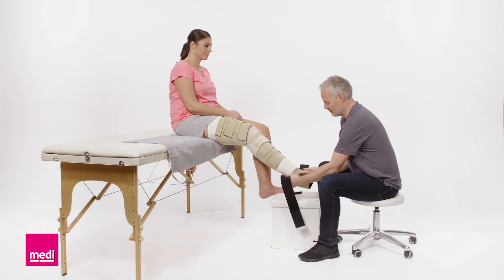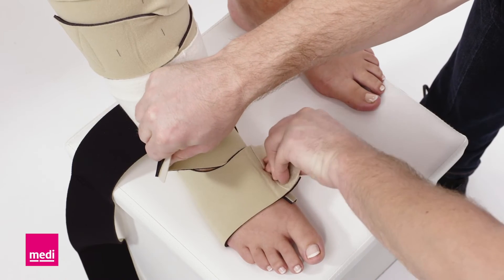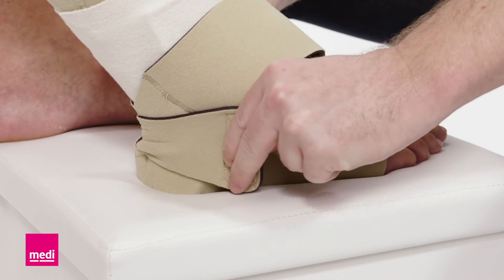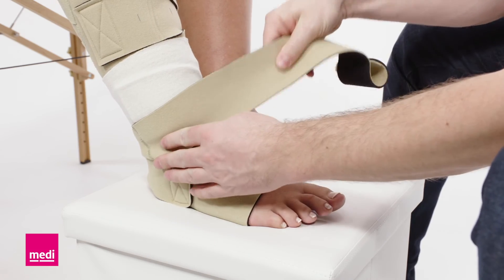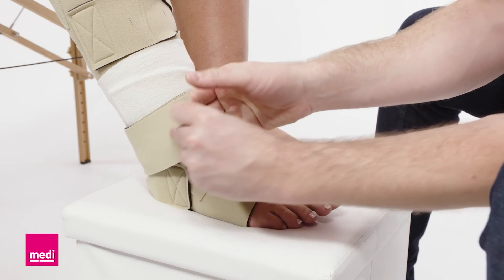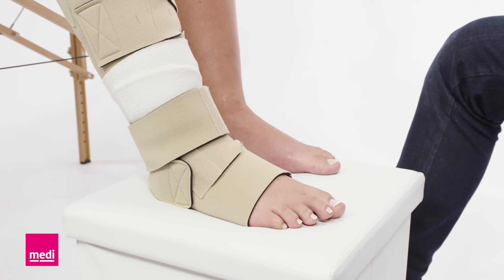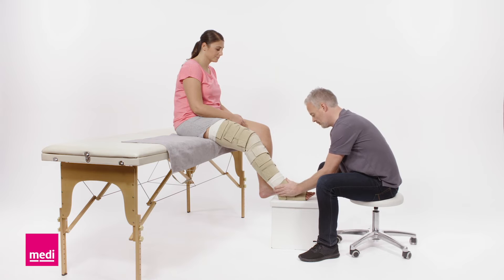Place the heel firmly in the heel opening. Attach the front two bands with firm and comfortable tension. Now loosen and tighten the heel bands to readjust the foot length. Take the ankle band and pull it around the ankle. Ensure that the ankle band overlaps with the lower leg garment. Make sure that there are no gaps or wrinkles. The bands should always be tightened with firm and comfortable tension.